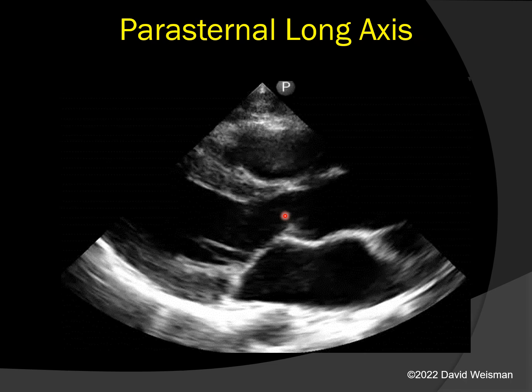We will look at the left ventricular outflow, the LV cavity, the inferior lateral wall of the left ventricle, the bright pericardium. And a very important landmark is this. This is the descending aorta. And typically, you like to see the descending aorta to make sure you are at the optimal depth for the patient. We are also visualizing the posterior leaflet of the mitral valve and the anterior leaflet of the mitral valve. Let's play this clip and identify structures once again.